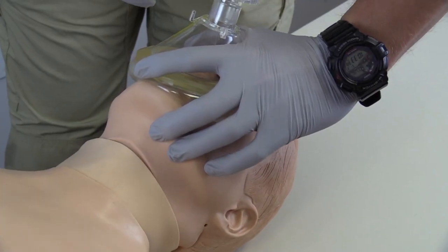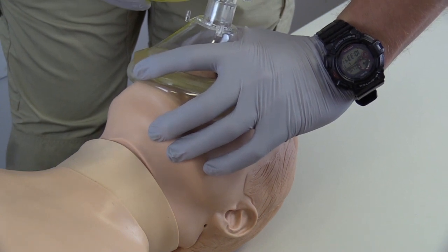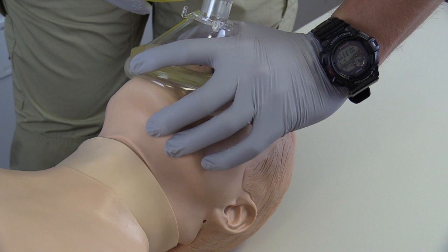I will then deliver ventilations at a rate of 1 breath every 5 seconds, or approximately 12 breaths per minute. I will watch for chest rise and fall to determine if proper volumes of air are being delivered. After 1 minute, I will reassess the pulse, and if the patient remains apneic, I will continue to deliver ventilations.